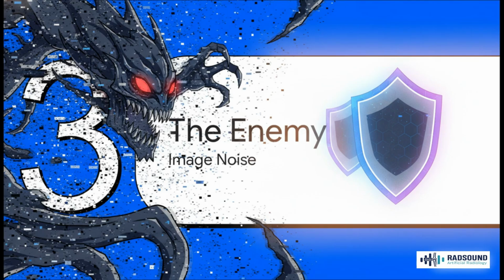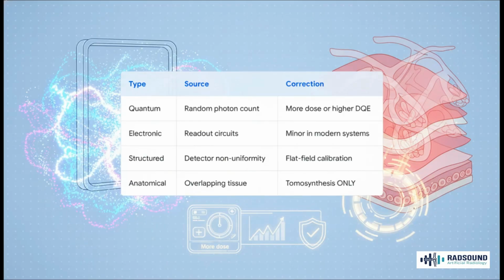And that leads us right to the third corner of our triangle, and really the main villain of our entire story, image noise. This is the thing we are constantly fighting against. Now, there are 4 types, but let's be honest, quantum noise is the big one. It's just the inherent randomness of how X-ray photons hit the detector. Then you have what's called anatomical noise, which is sneaky. It's not really noise at all. It's just normal overlapping breast tissue that can perfectly mimic a lesion. And the crucial thing to remember is you can't fix anatomical noise by throwing more dose at it. The only way to sort that out is with a different technology, like tomosynthesis.